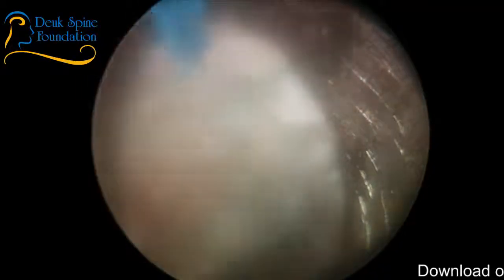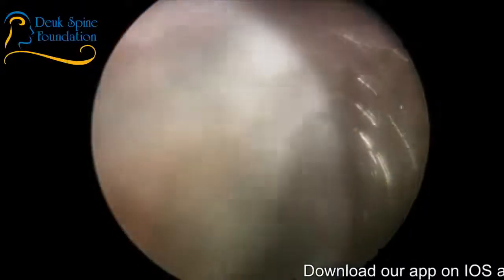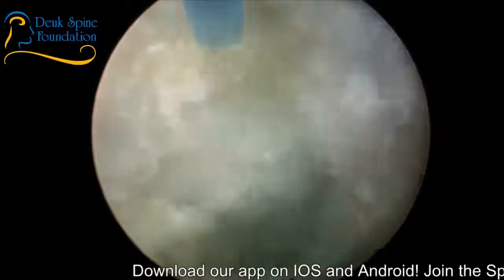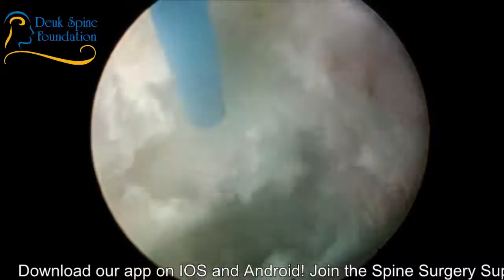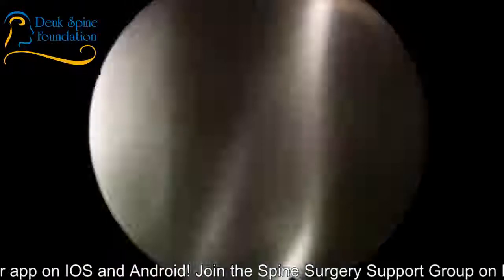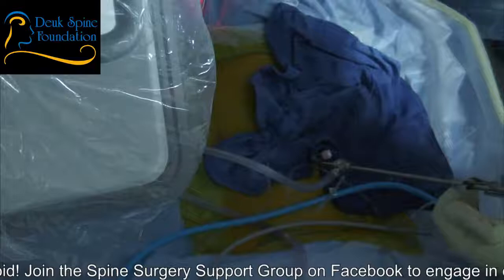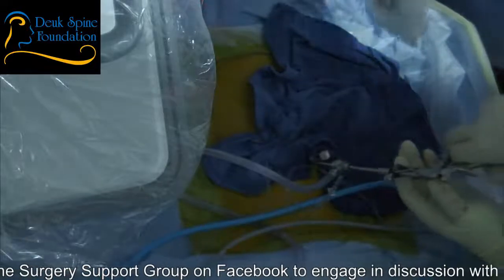All right, I want the Grabzilla. Look at all that scar tissue there. Massive. Tell me when you're ready. Standby laser. Standby scope. So Grabzilla is just a pituitary that I can control the tip of.